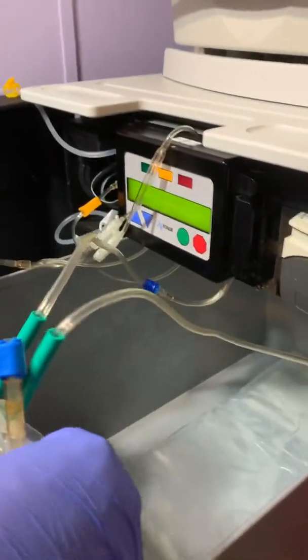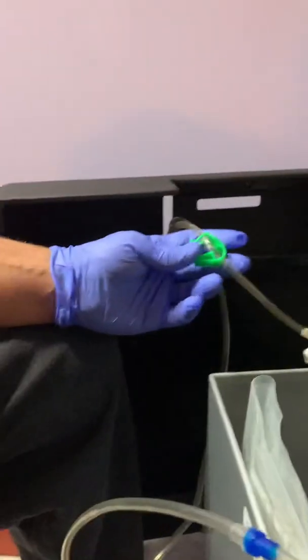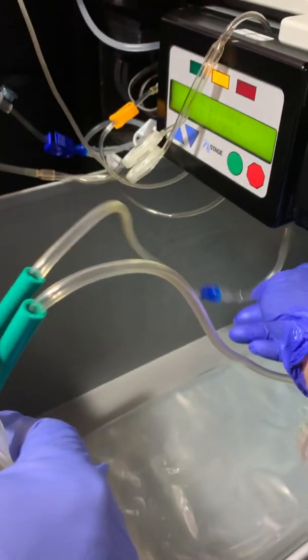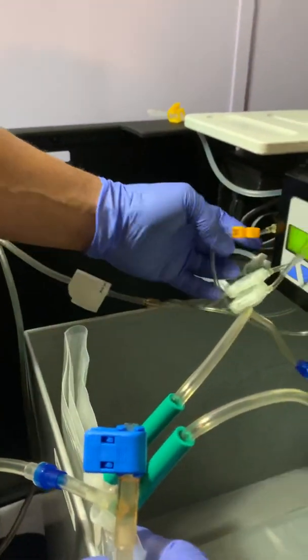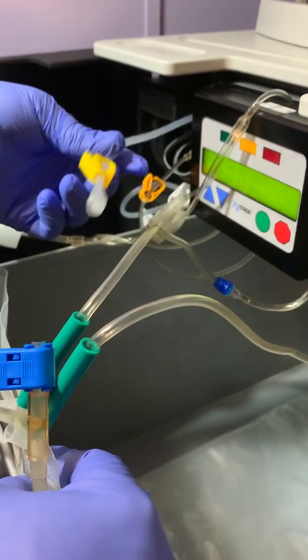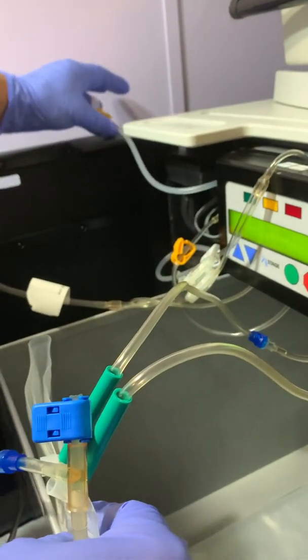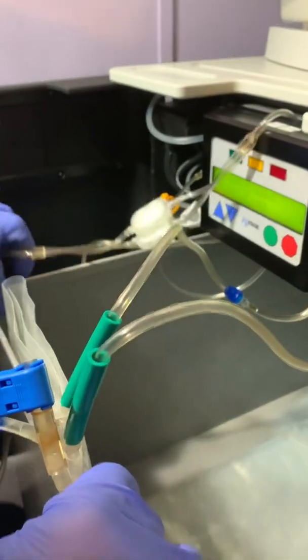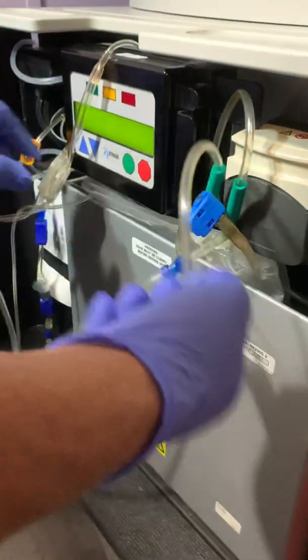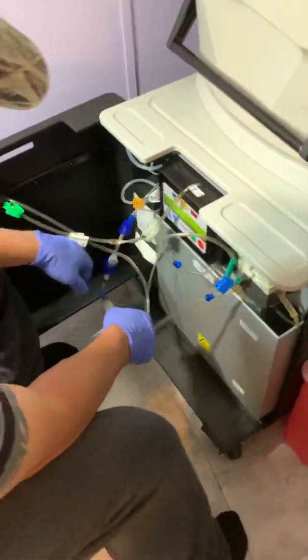Then once you've got all that connected, just double check. Make sure everything's open. This could be clamped if you want — you don't have to, but it's supposed to be that way. Make sure all these are loose. Make sure all your blue lines are open. Make sure your orange lines are open. There's a yellow line that's not connected and that won't be connected — you can clamp it if you want but it doesn't do anything right now. So I just put it out of the way and slide this back closed so all my lines are kind of out.